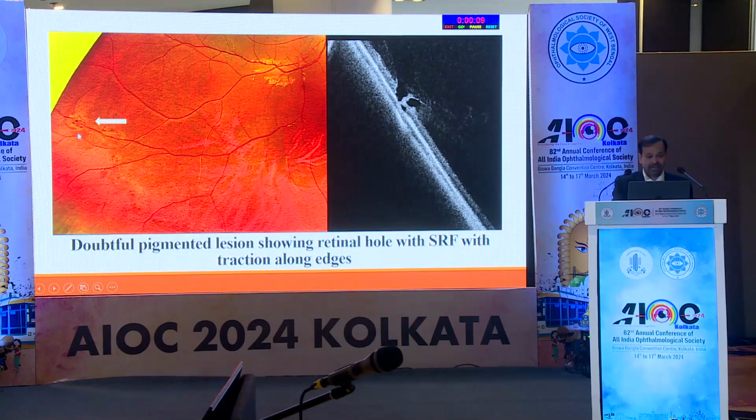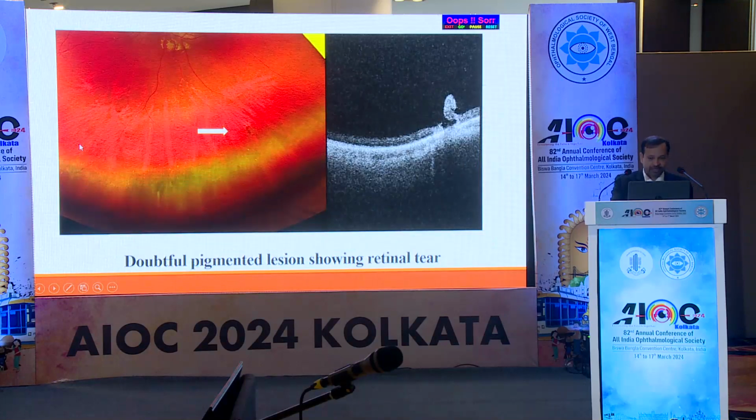If you can see here, a very non-specific lesion, you cannot categorize it into anything. There is some pigmentation here. You do the OCT, and you can see there is a very well localized traction over here along with a full thickness hole. Again, this lesion, in this scenario, it would be better to treat.